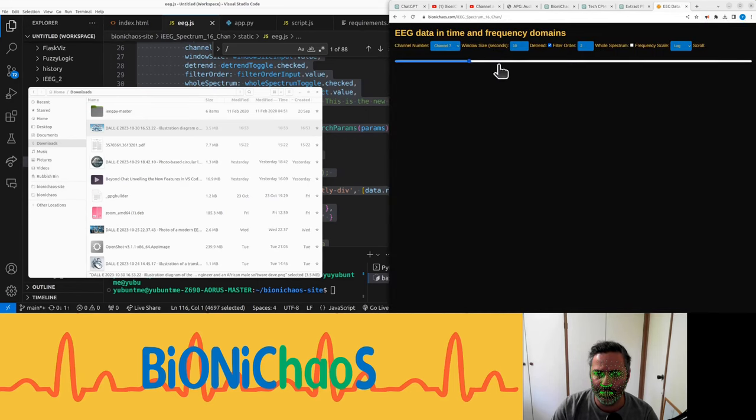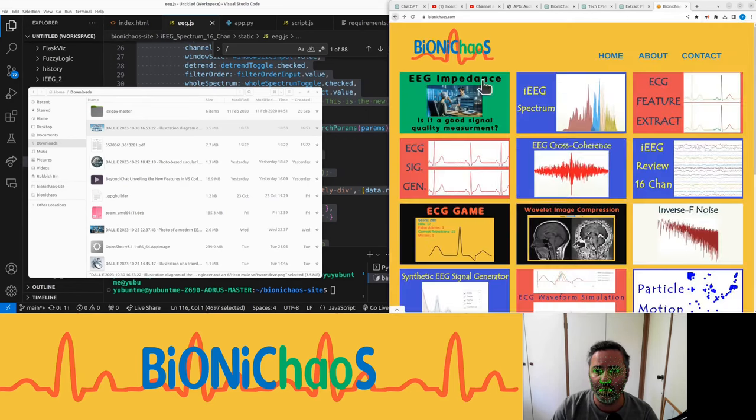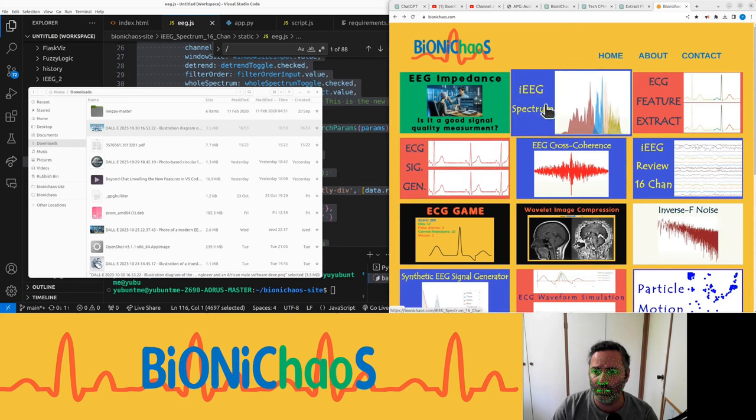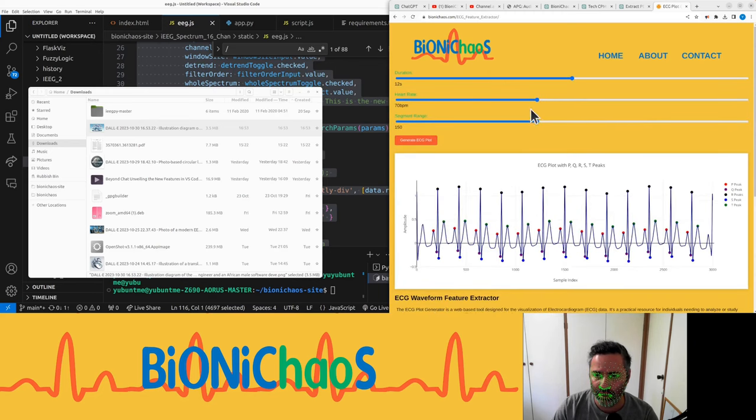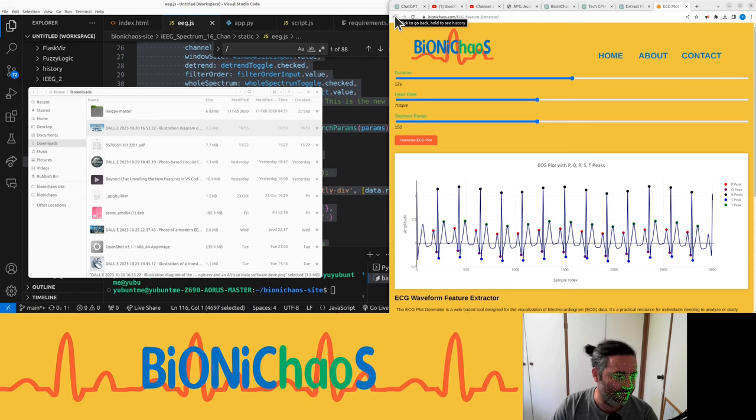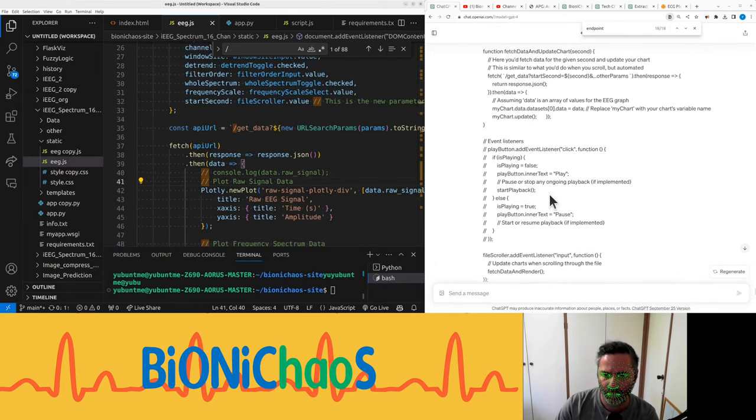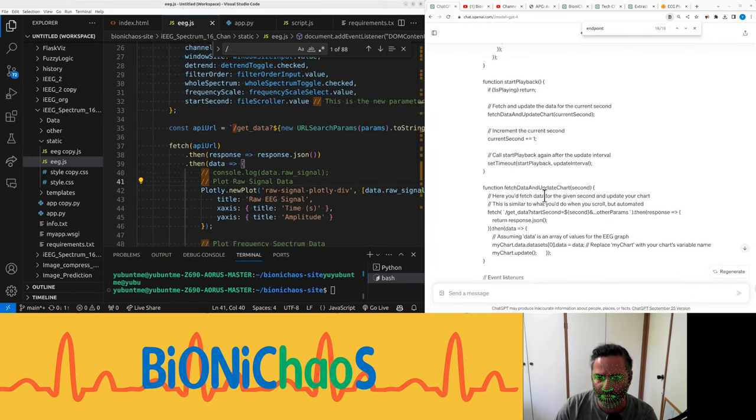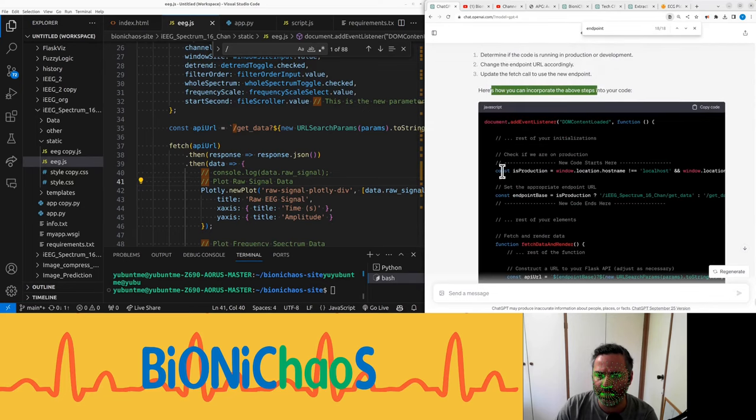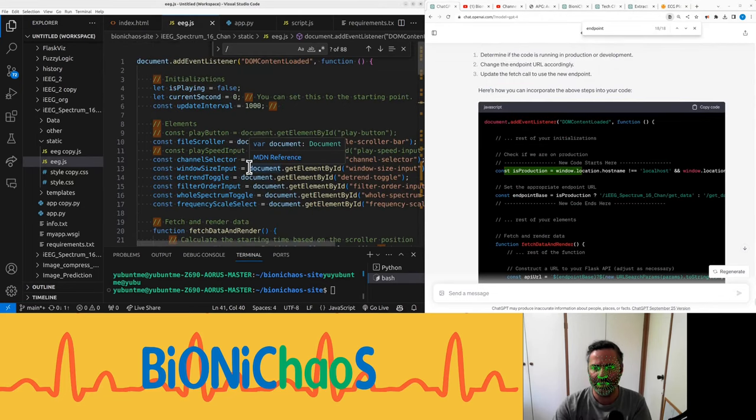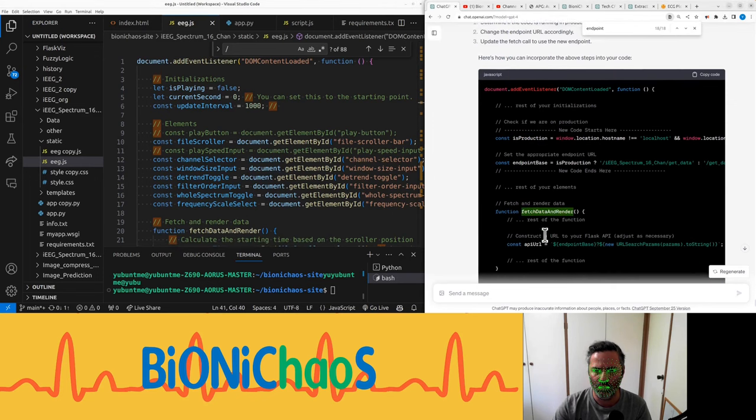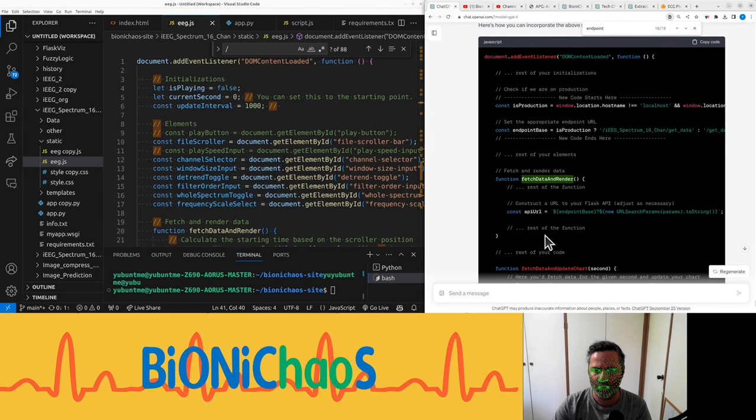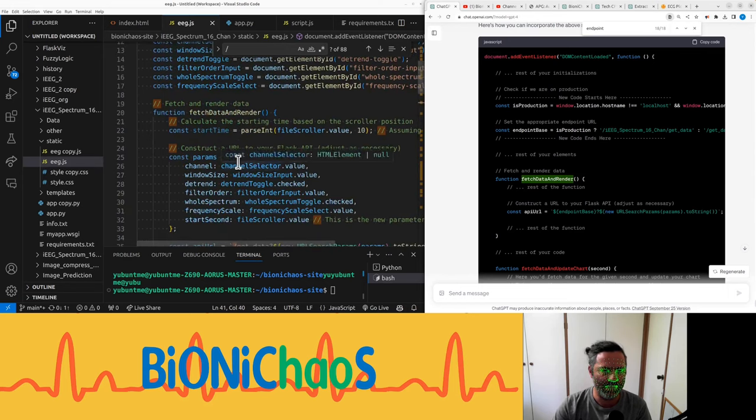Okay, we're still fixing this one. As you can tell, it's not really working. It should look something similar to this, but with EEG. We had ChatGPT doing some changes for us. That is great, and it should go before fetch data and render.